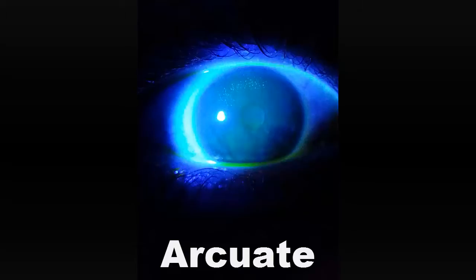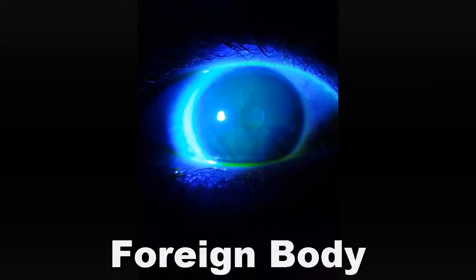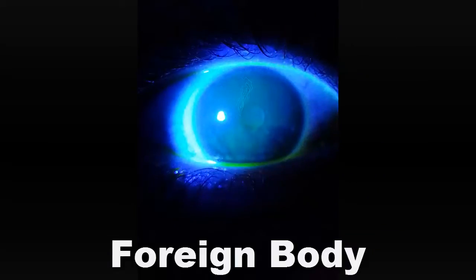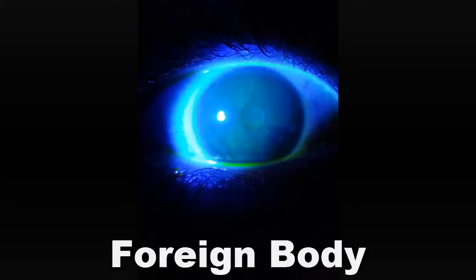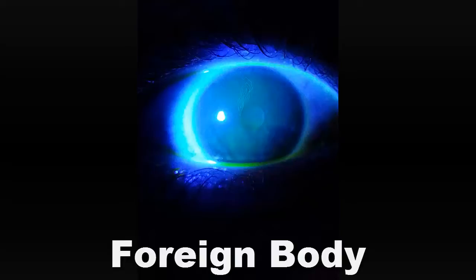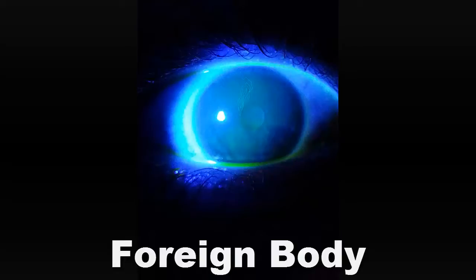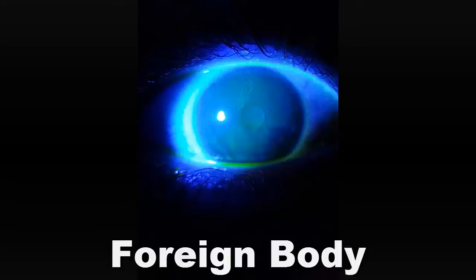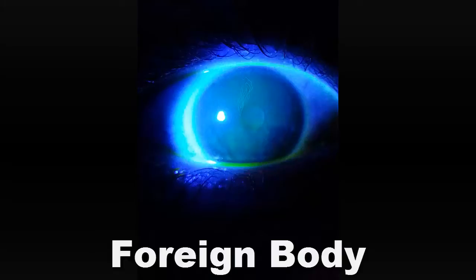Last one — it's an easy one. These are foreign body tracks. Why does this happen? This has to do with a foreign body trapped under the lens. How do you fix it? Because of the pain involved, the patient probably already removed the lens. Evaluate the lens and make sure it is clear of any foreign object. As far as the patient is concerned, a lens holiday of a day or two should do the trick.